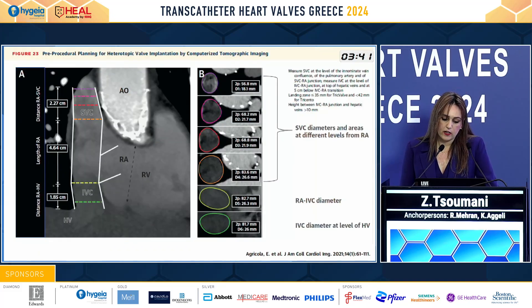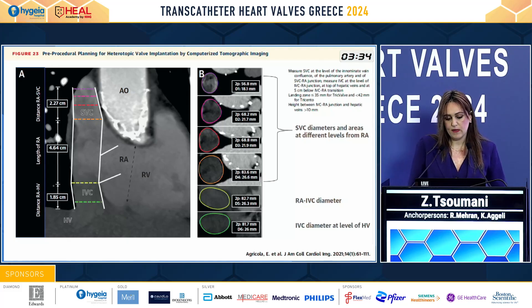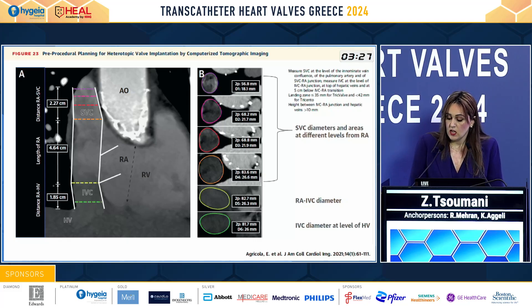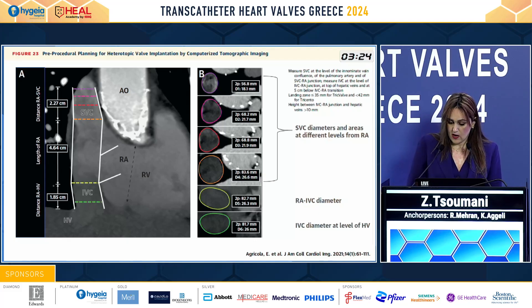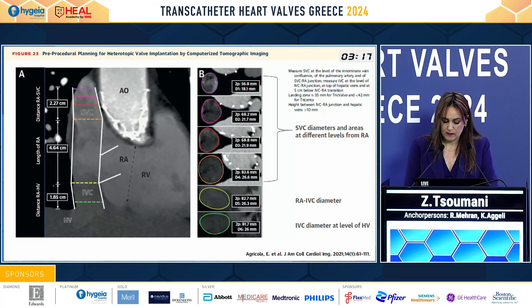If we are going for a heterotopic valve implantation, CT can help by measuring the SVC diameters and areas at different levels from the right atrium, the IVC diameter at the RA–IVC junction, as well as the height between the IVC and the first hepatic vein.